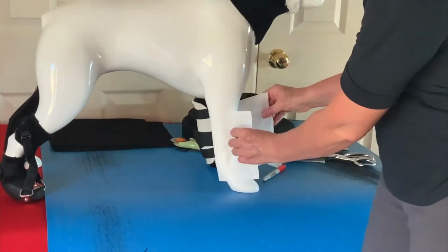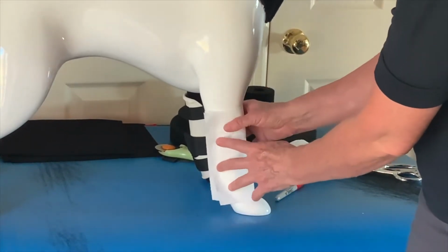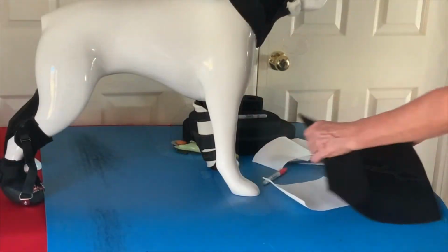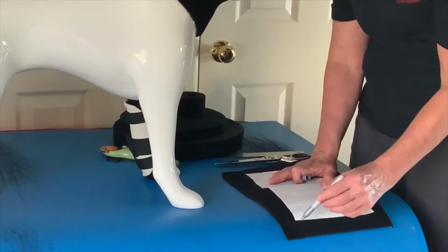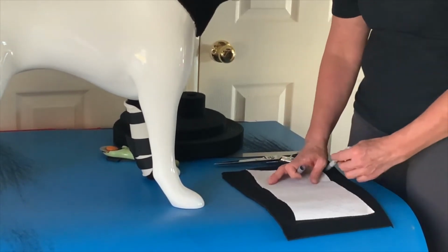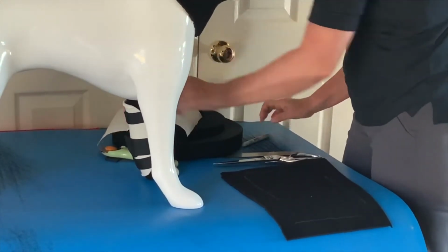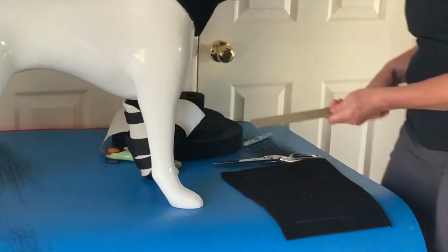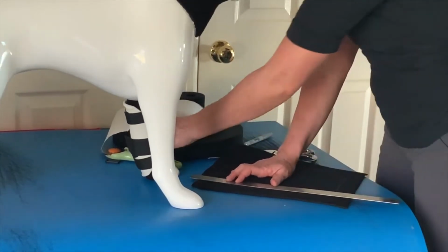Then check it against the limb and make sure you have plenty of room to overlap. Using a silver marker or a piece of chalk, trace your paper pattern onto your neoprene sheet. Then cut out your pattern using a rotary cutter and metal ruler, or you can also use the scissors.